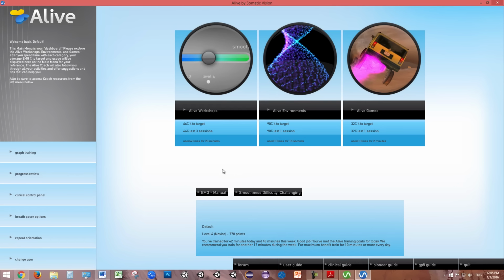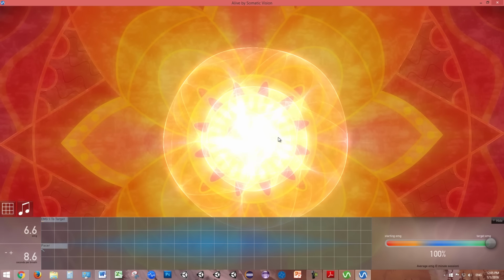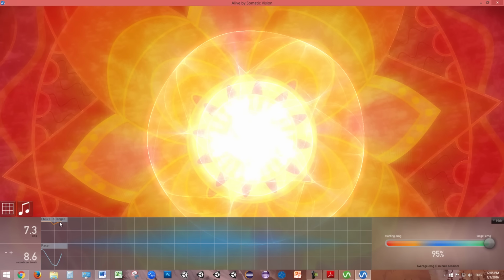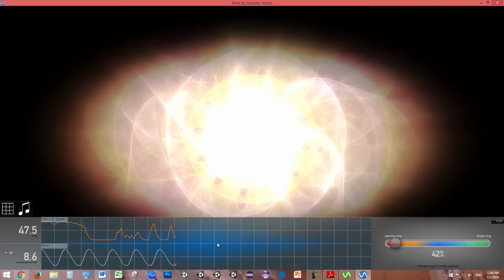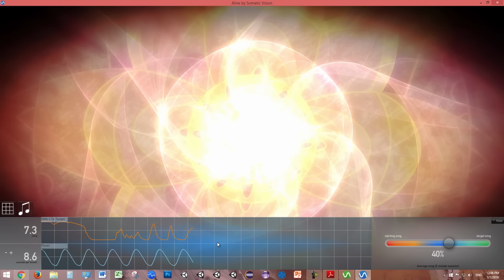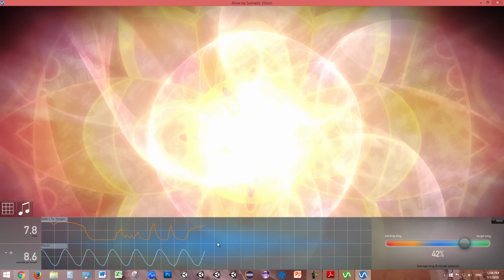From the Alive main menu feedback selection, I could choose EMG relaxation and then choose an appropriate environment such as the new Petals of Light environment. Now I want to raise this EMG percent to target line. Increases in muscle tension result in a darker and smaller display. As I relax, the black disappears, the music volume increases, and I fly forward through this beautiful environment.